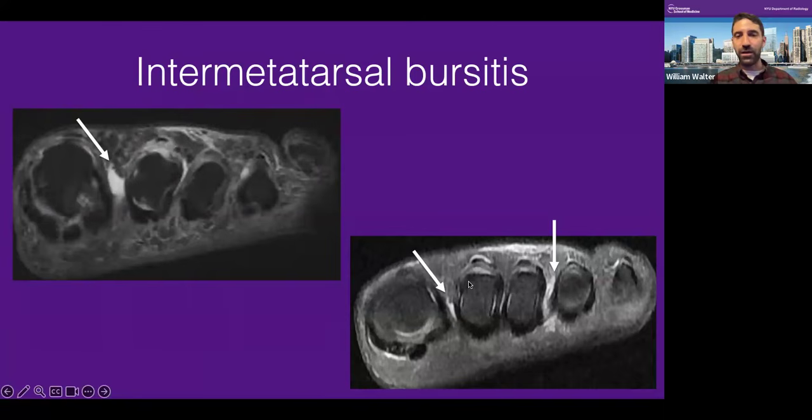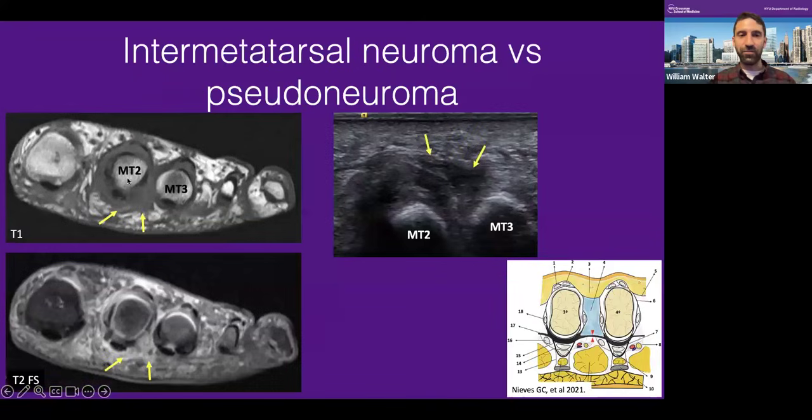We have reliable enough differentiation just on the anatomic and morphologic appearance that it's just not necessary, cost effective, or really the right move for the patient.